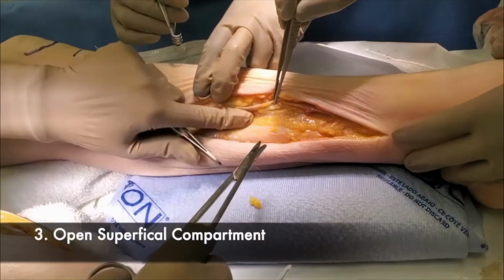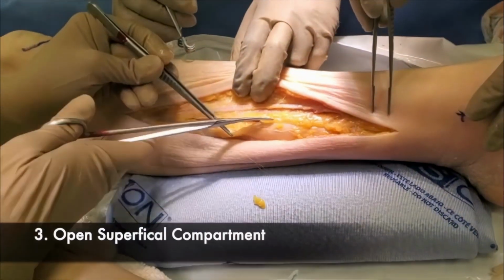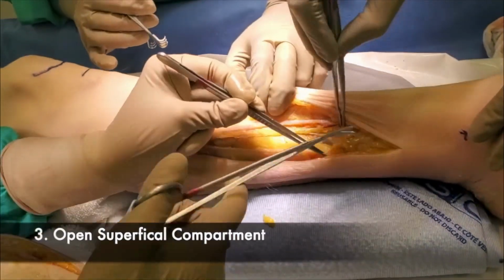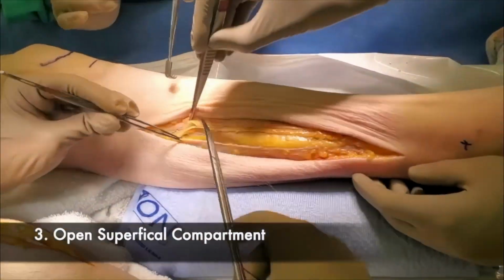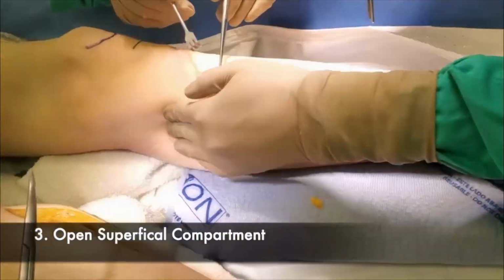To open the superficial compartment, cut through the fascia 1 thumb posterior to the posterior border of the tibia using partially opened scissors. Open the fascia from just distal to the medial tibiocondyle to just proximal to the medial malleolus so that you can clearly identify the soleus muscle, a key step towards locating the deep compartment.